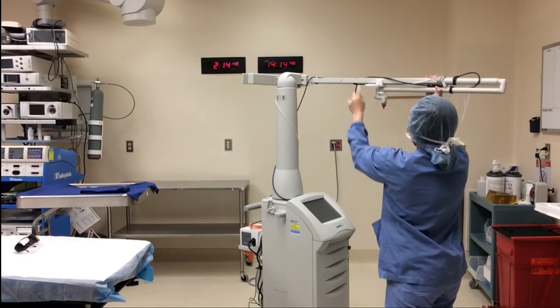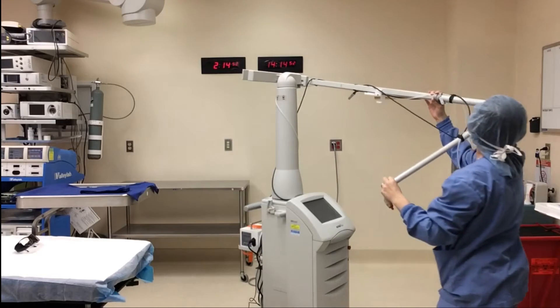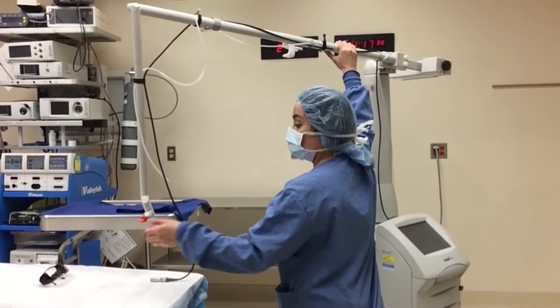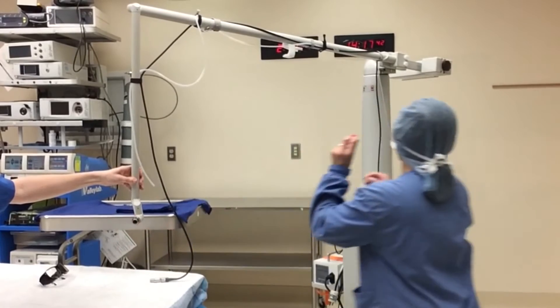There are up arrow stickers on the arm. Look for these to confirm it is in the correct position. Start by taking the red lens cover off the lens. We keep the lens cover on the white knob by the weight.